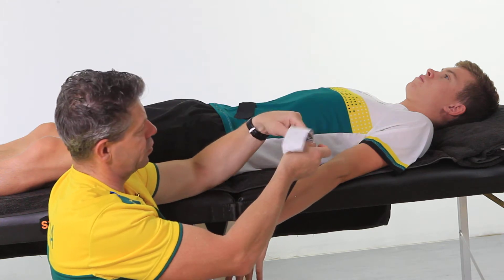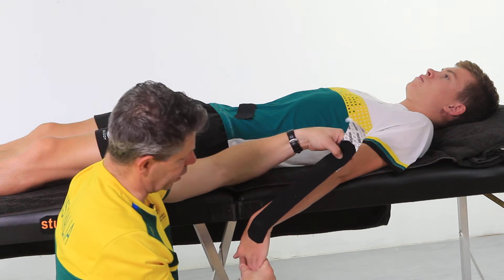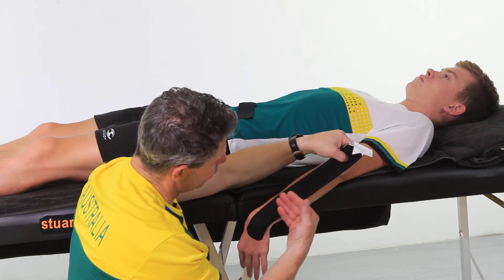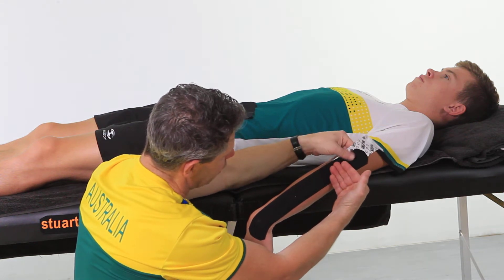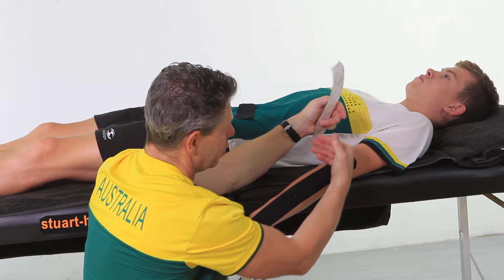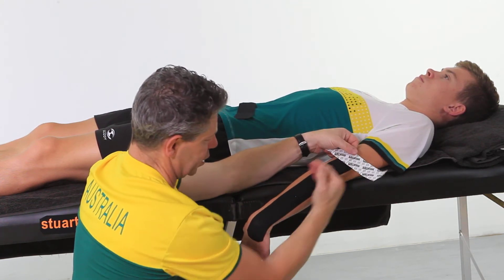Then you're going to put the wrist in as much flexion as you can, and then run along the outside of the extensors at about 40 to 60% stretch. Give it a good rub.